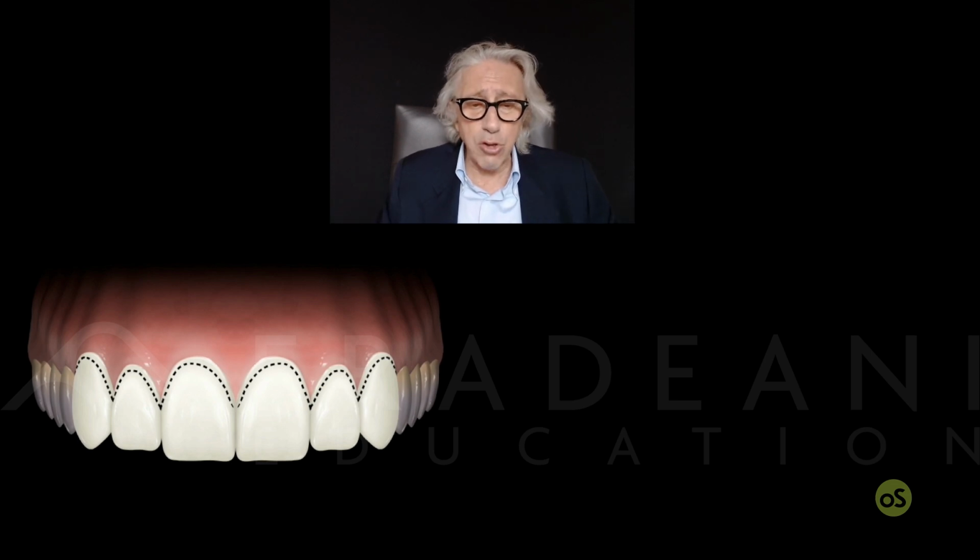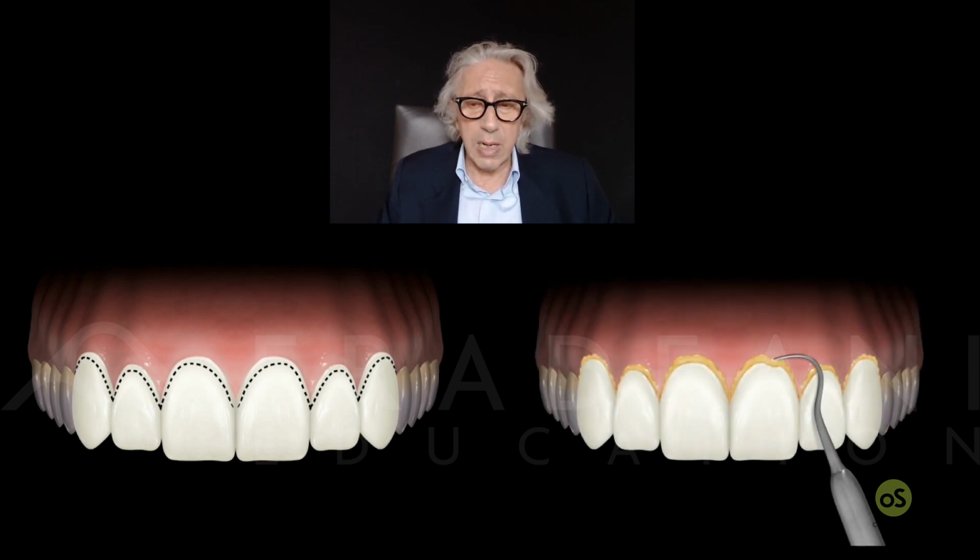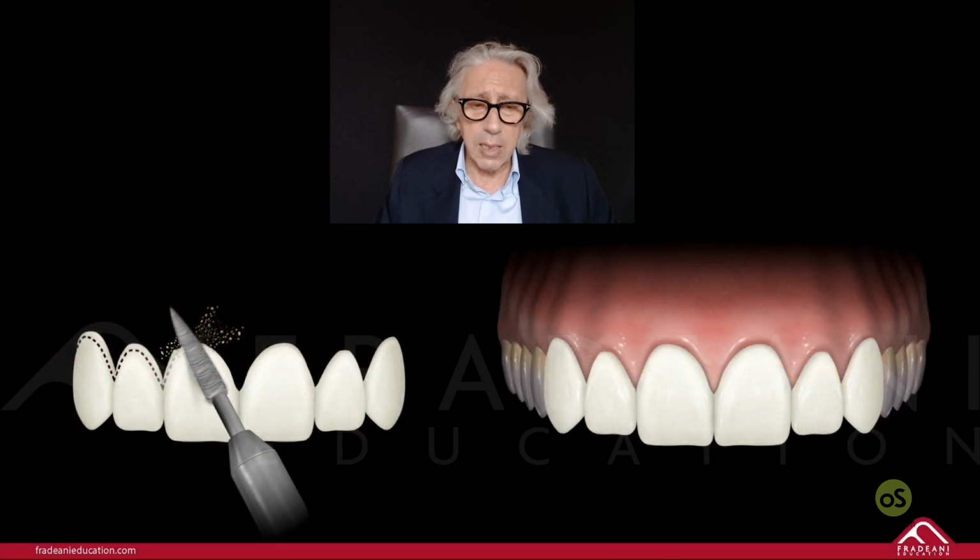In this case, it will be very easy. It will be guided by the occlusion. And then also you don't have to push with your finger to give your impression on the relining material. You don't need it. You can remove it because all the margin will be inside, not outside. So you don't need to do it. Your maneuver will be much easier because you will go in subtraction, not in addition.